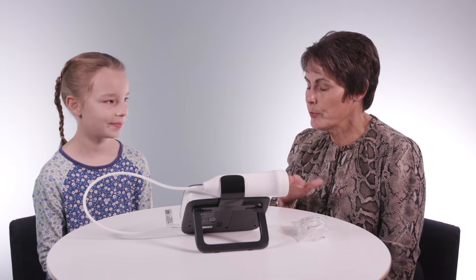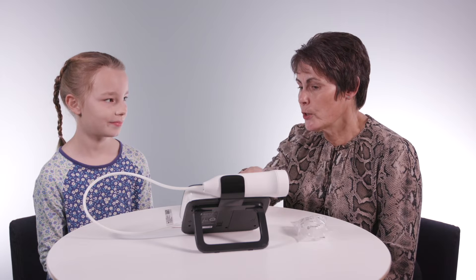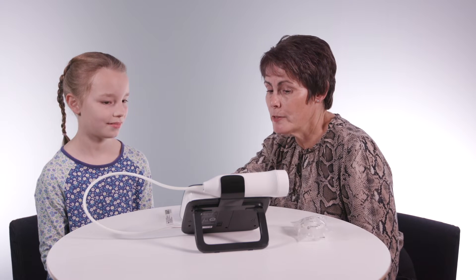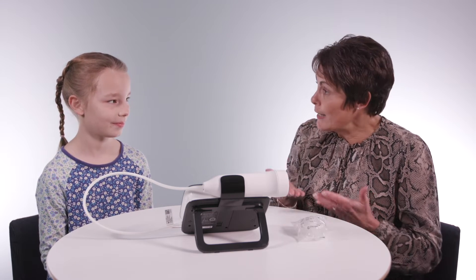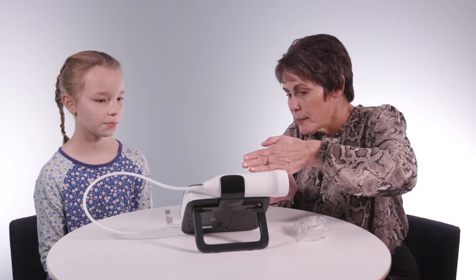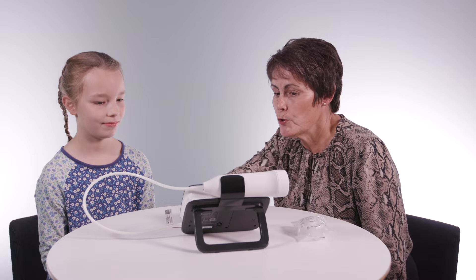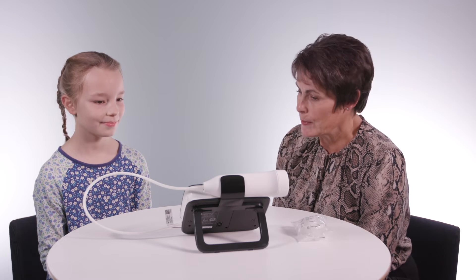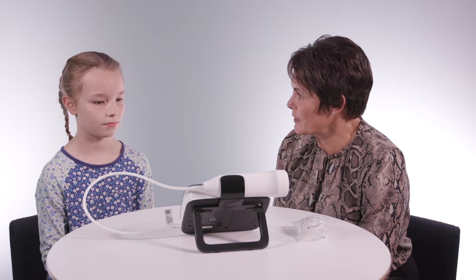So in order to help you when we're actually doing the test, you're going to see a picture on the screen. I'm going to show you that first of all, and what you will see is a picture of a little girl holding on to a balloon. So when I ask you to take a breath in, she'll rise up into the sky, and then you're going to blow out nice and steadily for me. The idea is that you're going to keep her balanced between those two white lines on the screen. So as you're blowing and blowing and blowing, that's what you'll see her doing.